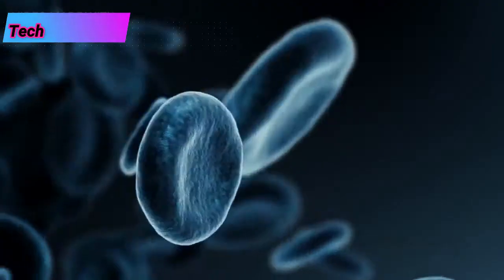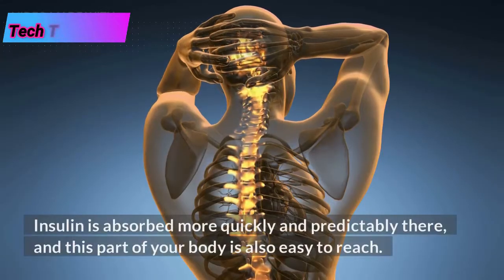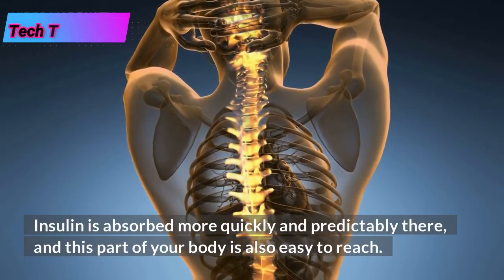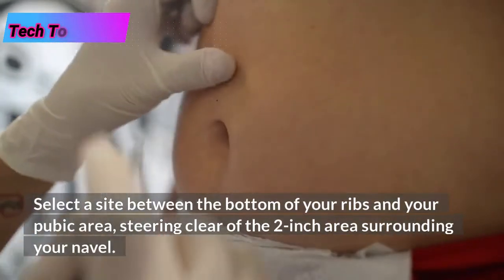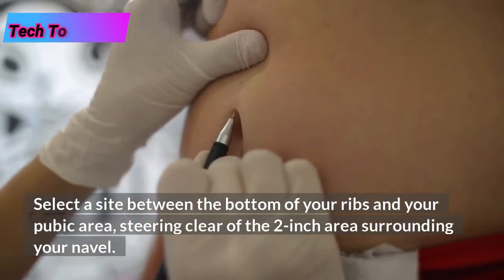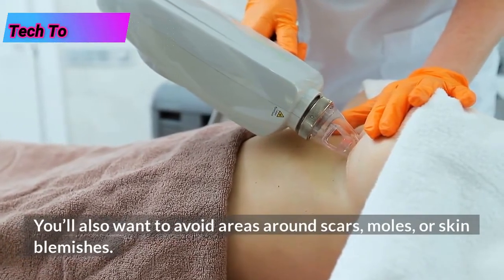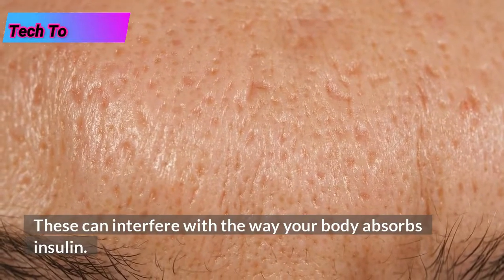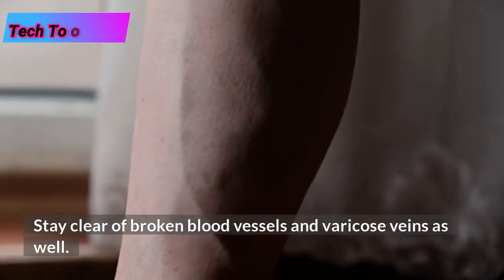Abdomen. The preferred site for insulin injection is your abdomen. Insulin is absorbed more quickly and predictably there, and this part of your body is also easy to reach. Select a site between the bottom of your ribs and your pubic area, steering clear of the 2-inch area surrounding your navel. You'll also want to avoid areas around scars, moles, or skin blemishes. These can interfere with the way your body absorbs insulin. Stay clear of broken blood vessels and varicose veins as well.